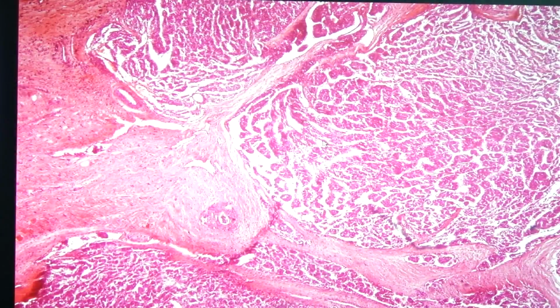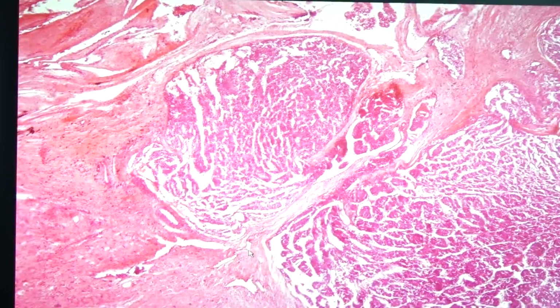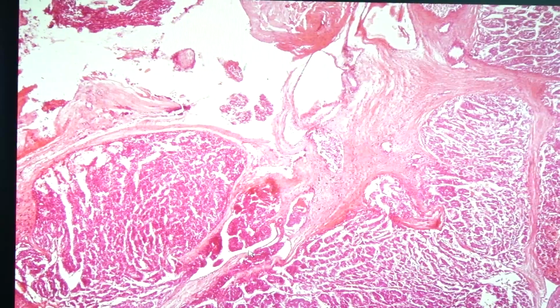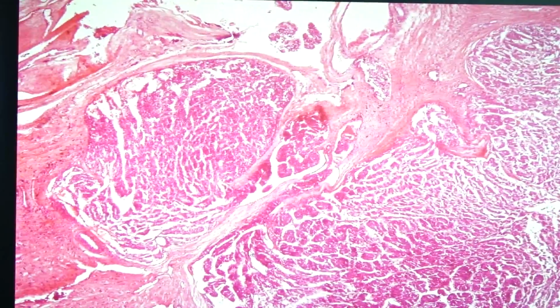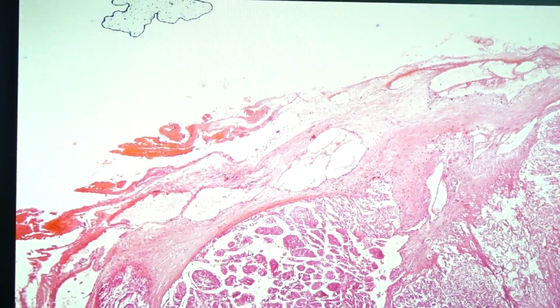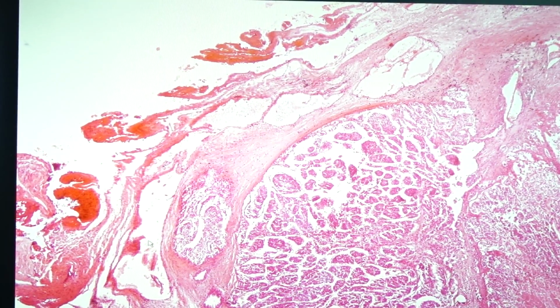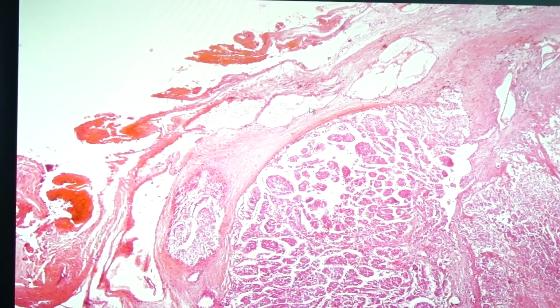And then here, if you look at the bigger picture, there's already a nodule outside of the capsule, and this is already follicular carcinoma. So capsular invasion, and then you look for another criteria, which is vascular invasion. You can see here the presence of some of the blood vessels, vascular areas.